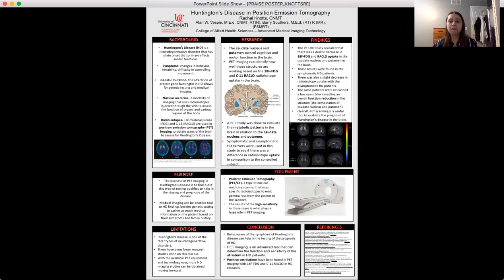So there's that. And because of this though, and with the technology we have now with PET imaging and the equipment, there can be more Huntington's disease imaging done moving forward, just because we do have new tools and we have great PET scanners that have a CT attached to them. And this has been going on for now 4 decades of the scanner evolving. So that can be used just moving forward with this type of research.